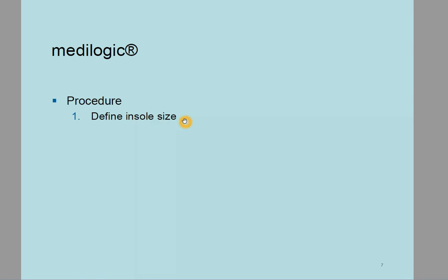So if you have chosen the right one for your shoe size, you can prepare the test person, and for the preparation you need to fix all the wires on the person so that they are not wobbling around loosely, and then you can perform your first offset measurement.